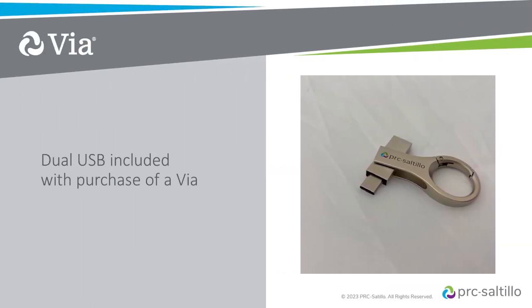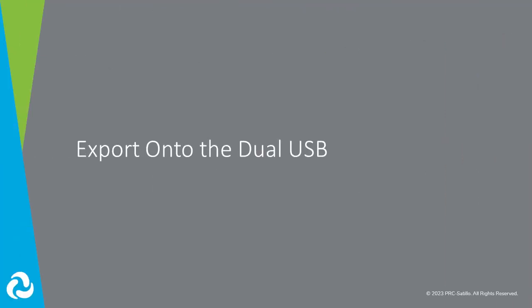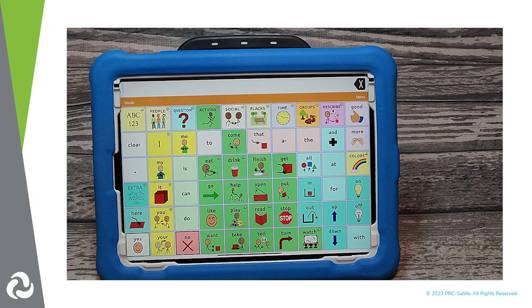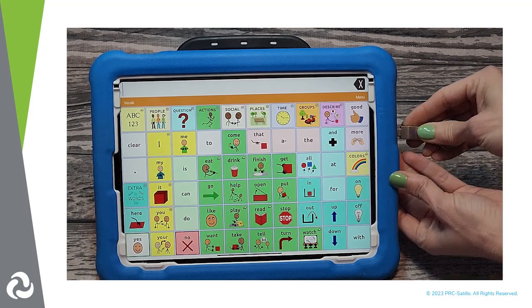You can use the dual USB that comes with your Via with TouchChat to back up and transfer your customized vocabulary file. Start by swiveling it so that the smaller side is visible. Let's start with exporting onto the dual USB. Locate the charge port on the side of your Via device and insert the dual USB into the port.